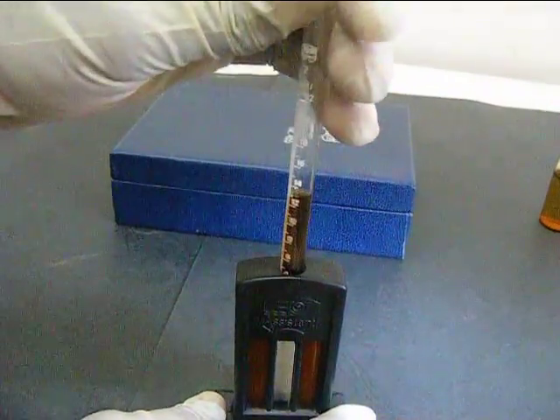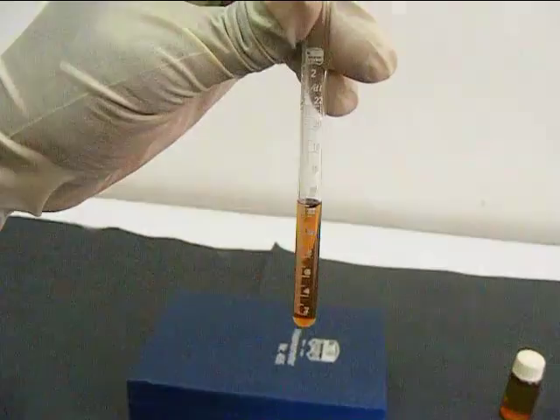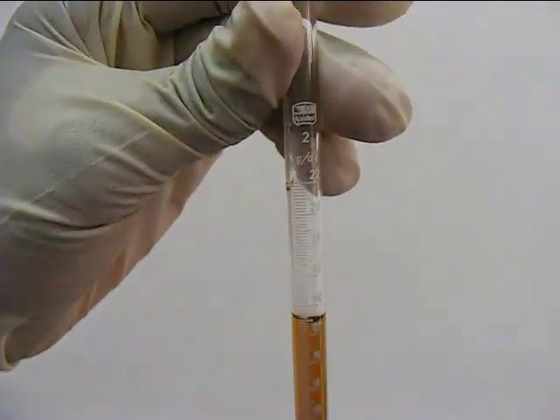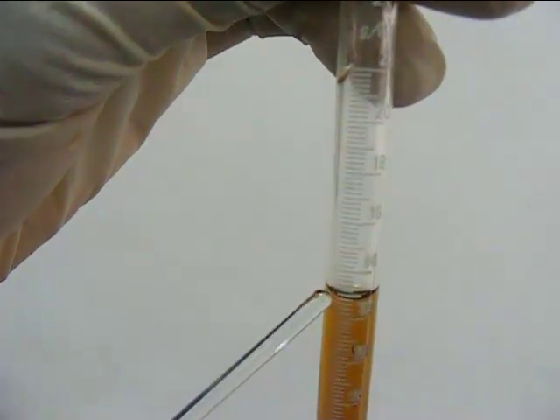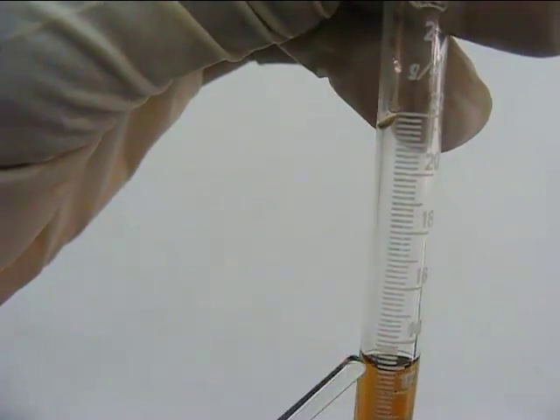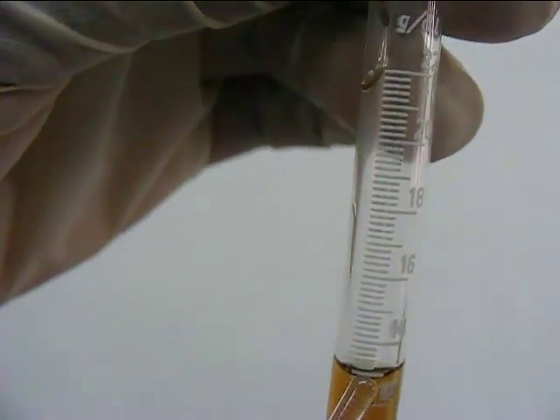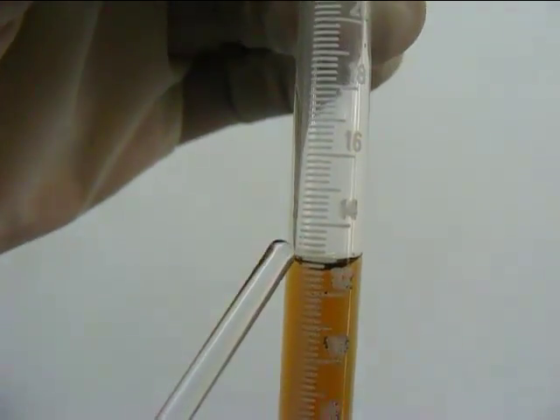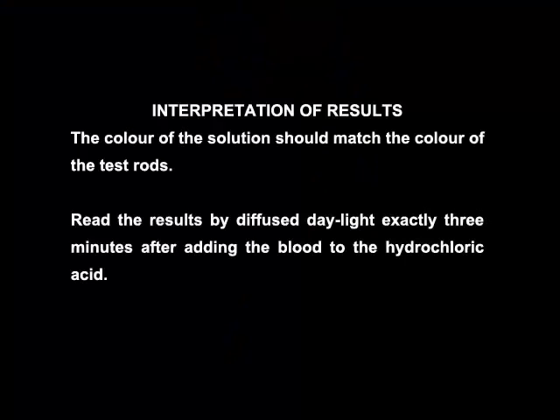The hemoglobin concentration is then read on the graduated glass tube. Interpretation of results: The color of the solution should match the color of the test rods. Read the results by diffused daylight exactly 3 minutes after adding the blood to the hydrochloric acid.